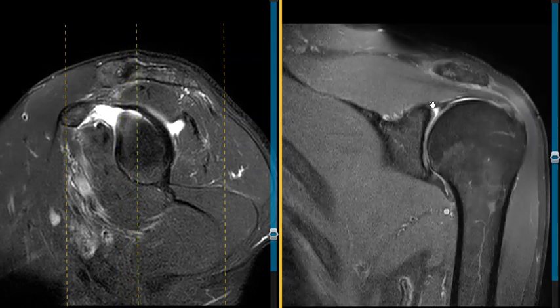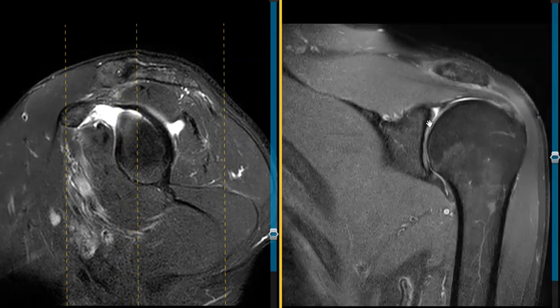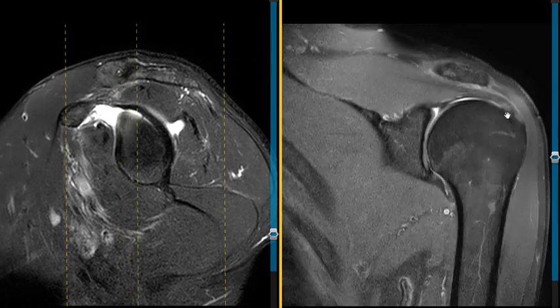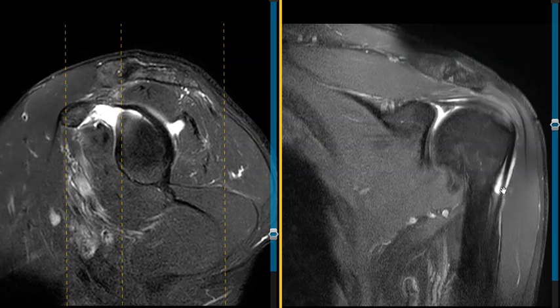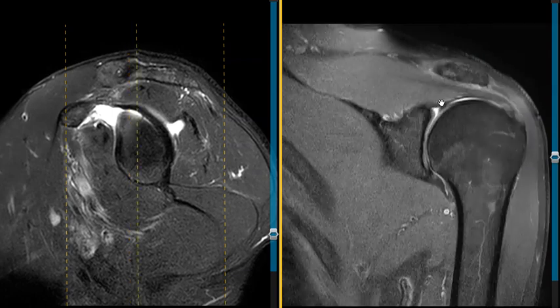I always like to tell them how thick it is from top to bottom. This looks like it's more than 50% — maybe 50-60% vertical thickness — and the tear is uplifted on the inferior margin. This thing coming across here is part of the biceps tendon; the biceps wraps around, comes up, loops over, and comes over here. The biceps labral anchor is here where the superior labrum and the biceps labral anchor come together.